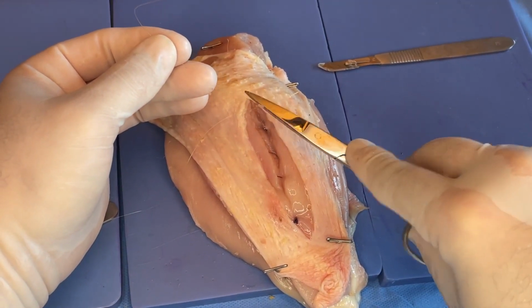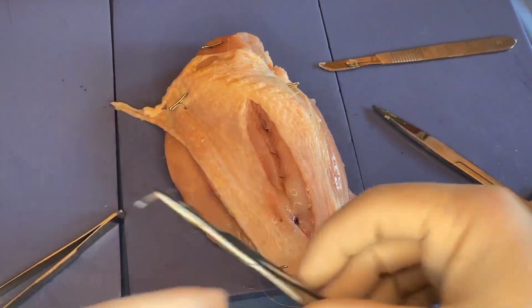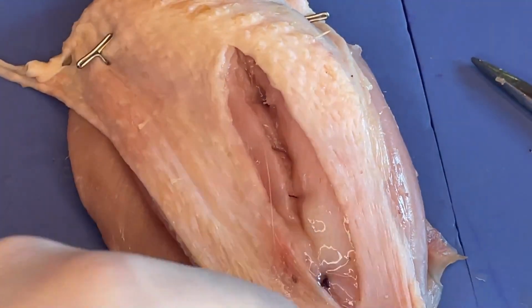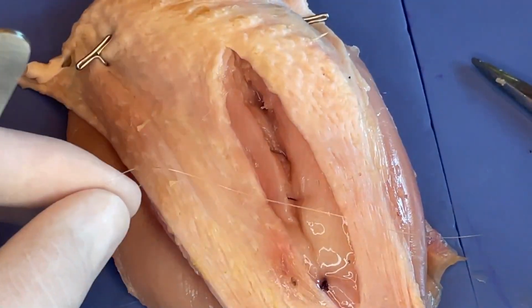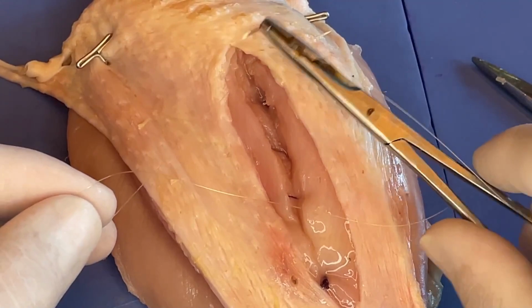And we'll cut just our short one. So what we have now is we've got, let me try to zoom in here so we can see this a little bit better. We've got our knot down here, kind of in that deeper tissue. And we're a bit away from the actual apex of the skin.